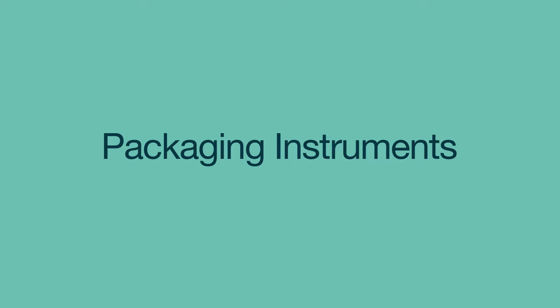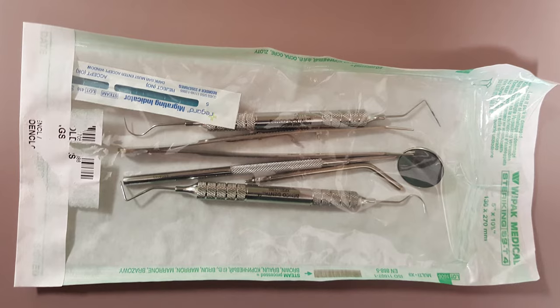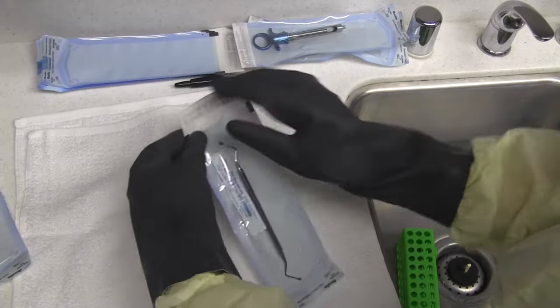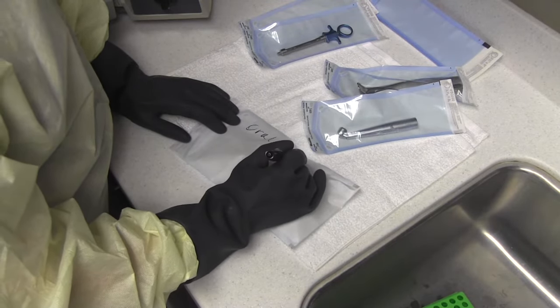Sterile instruments should be packaged or wrapped to protect them from becoming contaminated after sterilization. The most common sterilization packaging options are self-sealing or heat-sealed bags and paper wraps. Package sets of instruments together as they'll be needed, and label each package with a sterilization date and method.